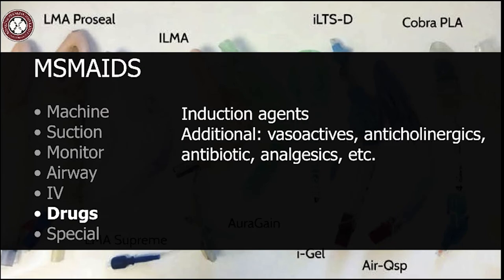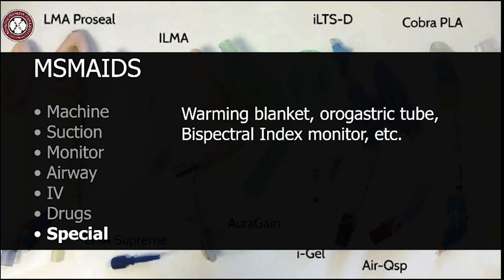Drugs refer to induction agents and any supportive medications such as vasoactives, anticholinergics, predetermined antibiotics, analgesics, etc. Special serves as a catch-all for any uncategorized necessities, including a warming blanket, oral gastric tubes, BIS monitor, etc.